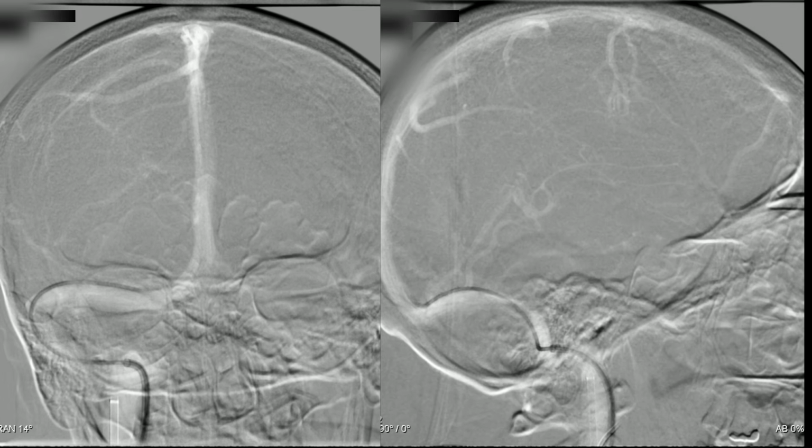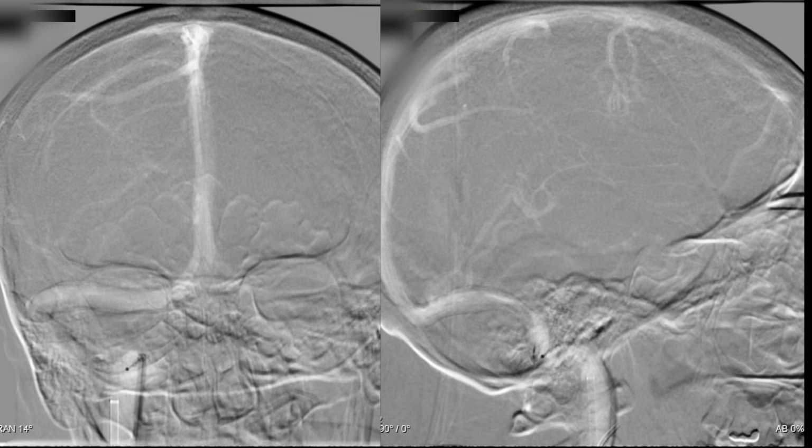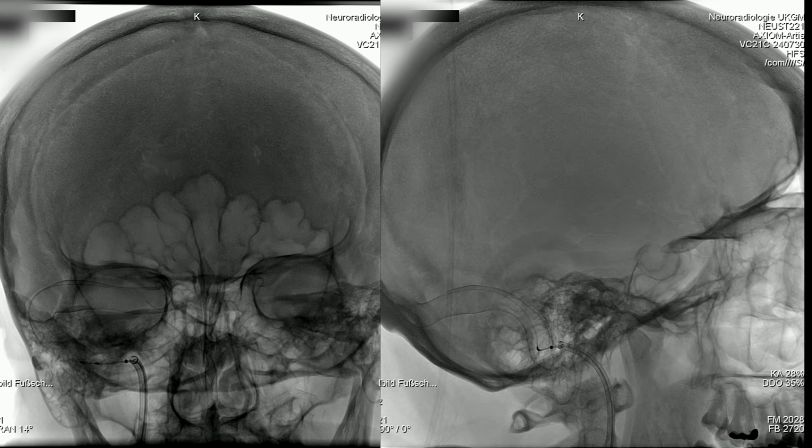We want to implant the CARESTO stent only in the transverse and sigmoid sinus. And as you can see, we have a very good wall adaptation, and the stent is going very well through the curves of the tortuous anatomy. And here we have the unsubtracted image, and the stent is well open.